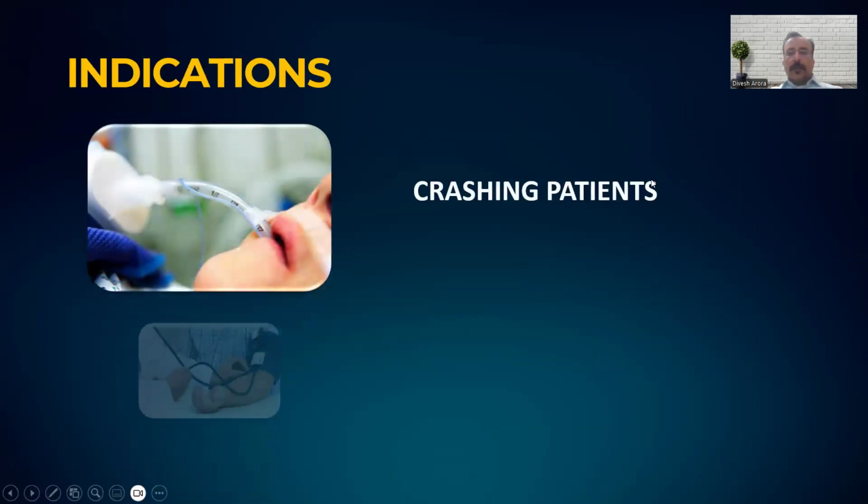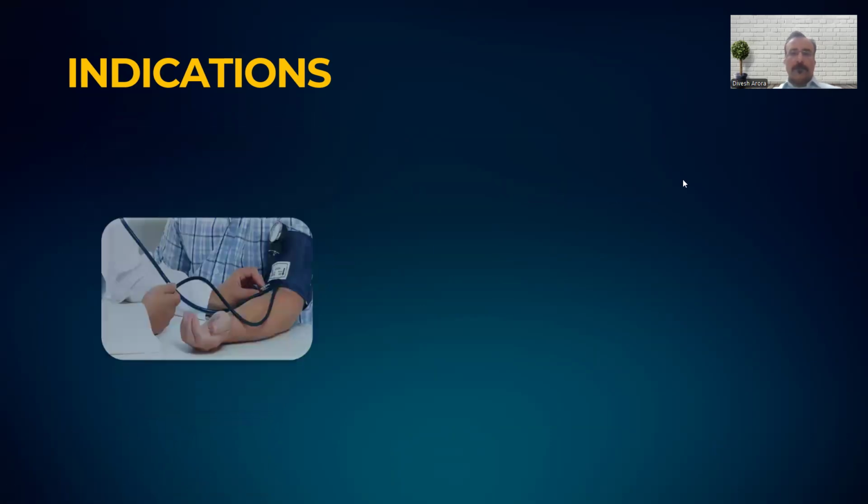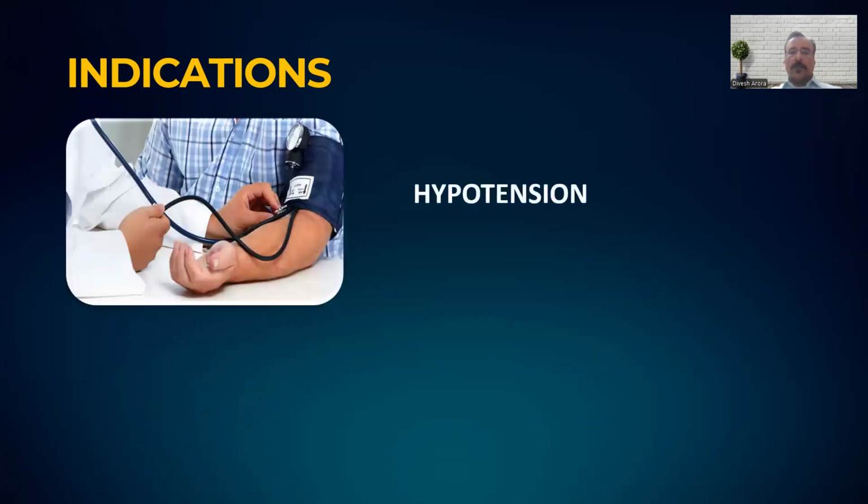And when we are working in ICU or ER, we have crashing patients. Immediately keeping an echo probe on the chest of the patient would answer so many questions. And definitely, unexplained hypotension in the perioperative or the postoperative period is a good indication for doing a FATE examination and assessment of left ventricle.